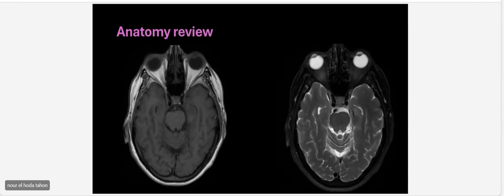Okay. And next, when you scroll up a little bit, you can see the cerebellum starts to end here, and you can see part of the bones here. Do you know what this part is? Anyone know? It is the aqueduct of Sylvius.